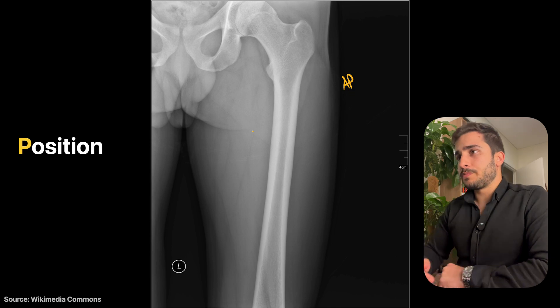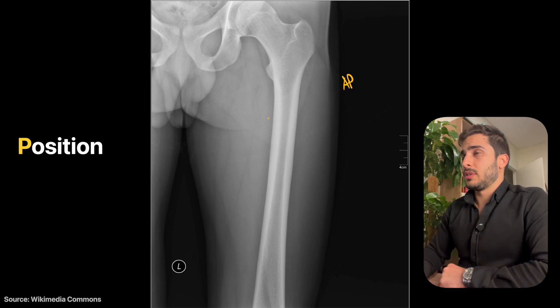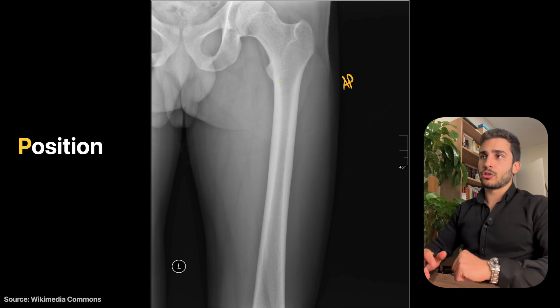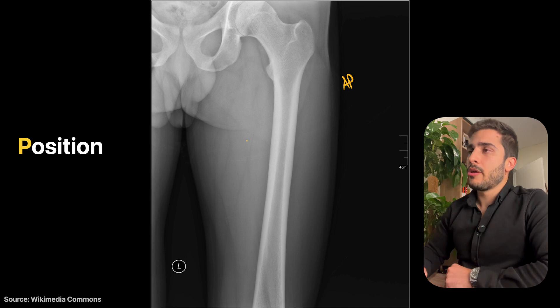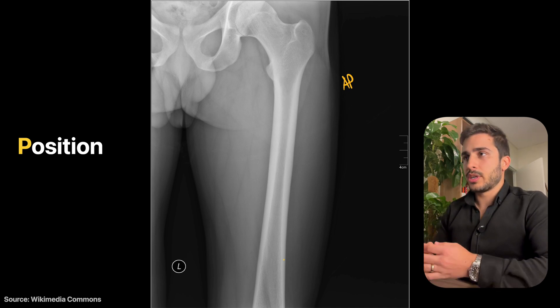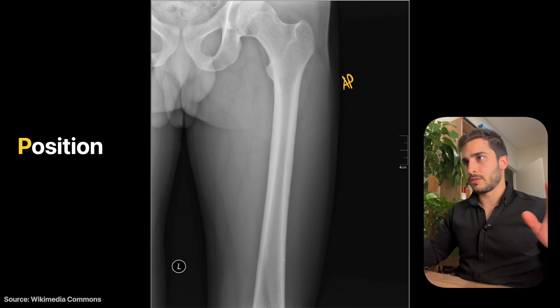Looking at positioning: is it rotated or tilted? It's definitely not tilted. You can see the greater and lesser trochanters are in profile, which means the patient was in pigeon-toe position as they should be for this x-ray. The position is quite good — it's nicely centered, there's no rotation.